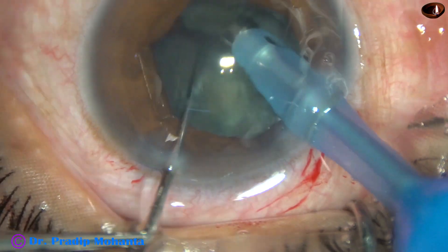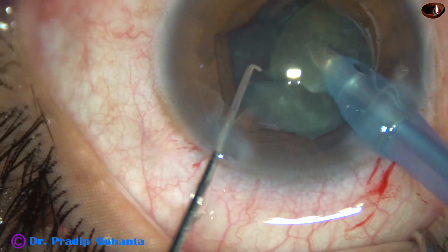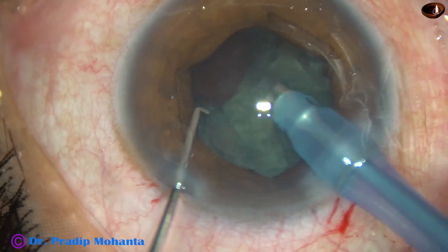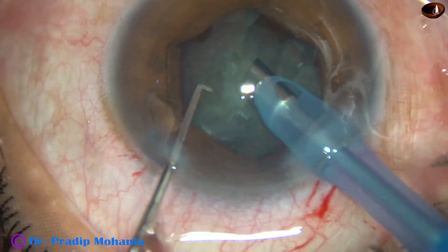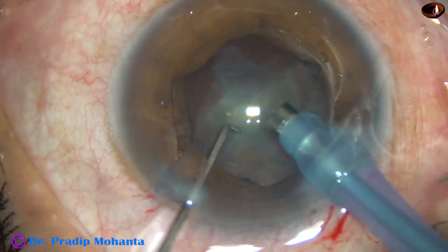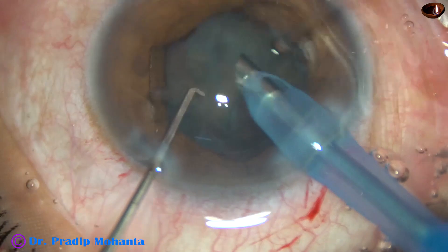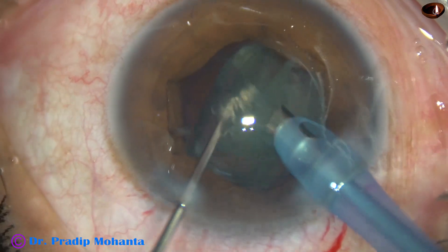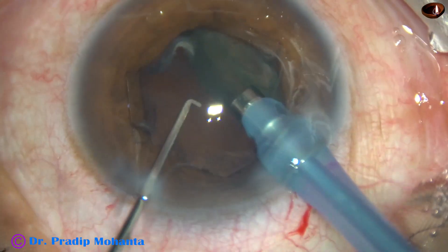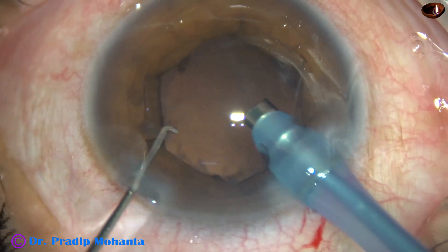Gentle hold — just engage the tip and chop the nucleus. Each nuclear fragment is emulsified with ultrasonic energy and the nuclear pieces are removed. This is the last piece of nucleus. It is removed. The epinucleus has also come out.